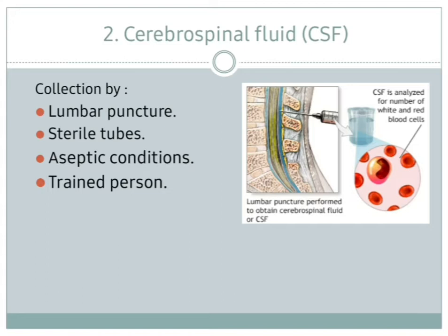Otherwise, you can introduce the pathogen to the cerebrospinal fluid, and this will cause serious problem. So you have to make the technique in aseptic conditions, using also sterile tubes, and the technique should be done by trained person.